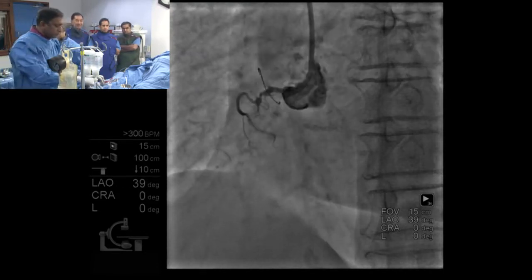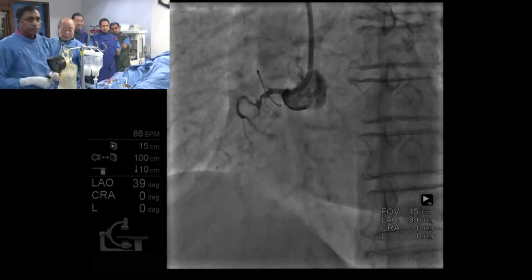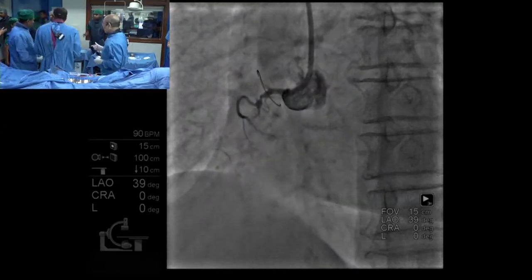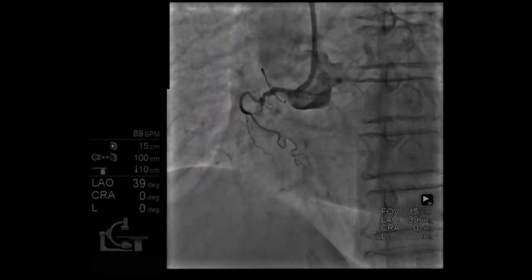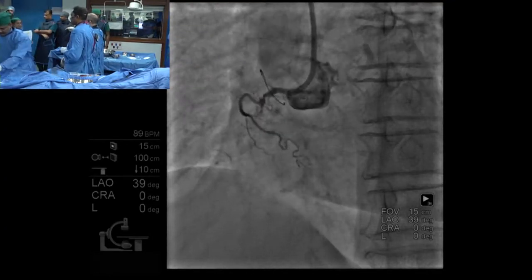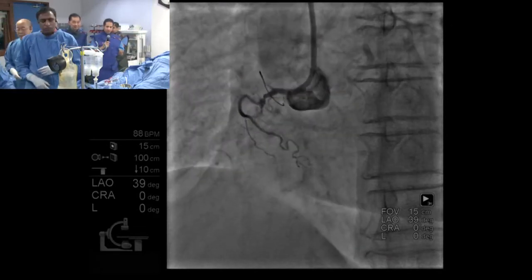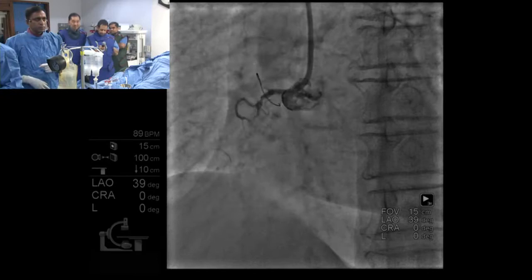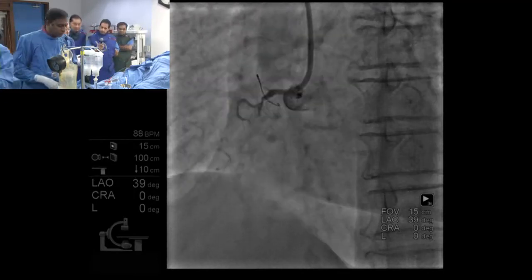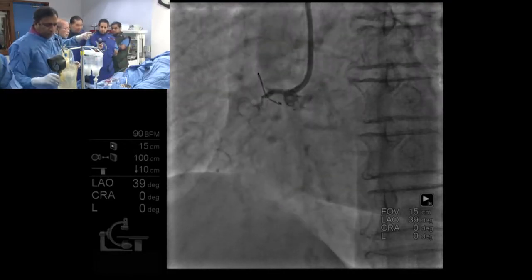Dr. Saito, what's your first wire strategy there? I want to take the Gaia Next first, on a microcatheter. Maurizio, do you use much of the Gaia family of wires in your CTO practice? Yes, in this kind of case, yes. But normally I start from XTA. But I can see some calcification.